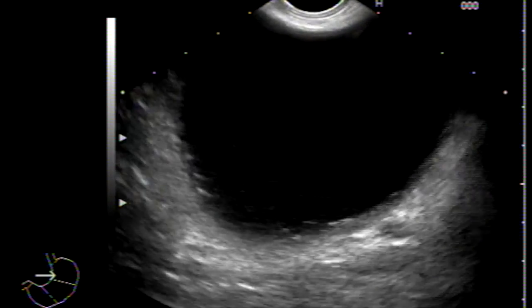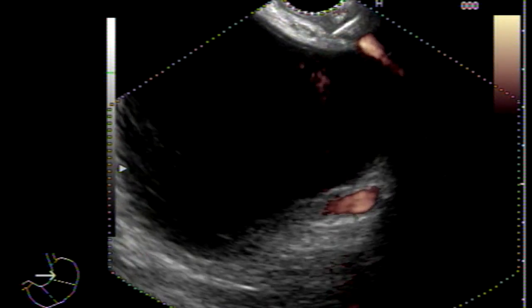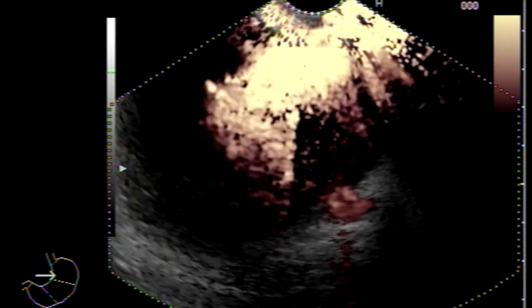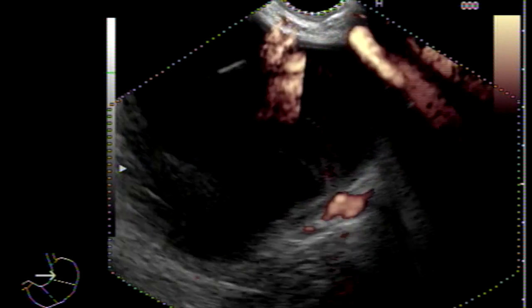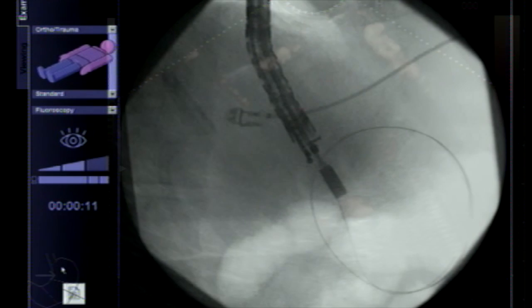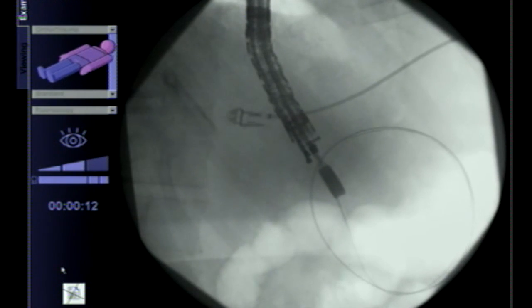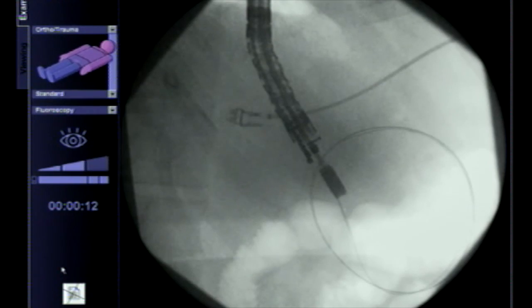Here is a pseudocyst, around six to seven centimeters in size. We are using Doppler to ensure there are no blood vessels in the way. Then we are introducing a 19-gauge needle, through which we advance a 0.035-inch guidewire, making sure the wire is coiling under fluoroscopic guidance.